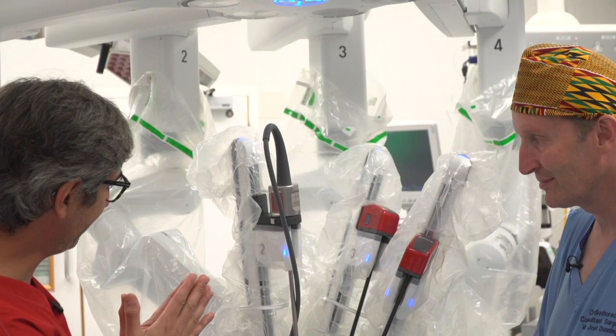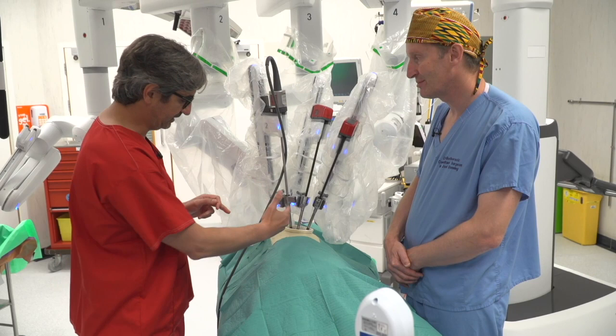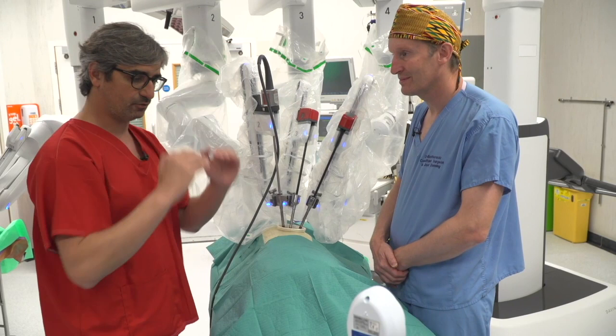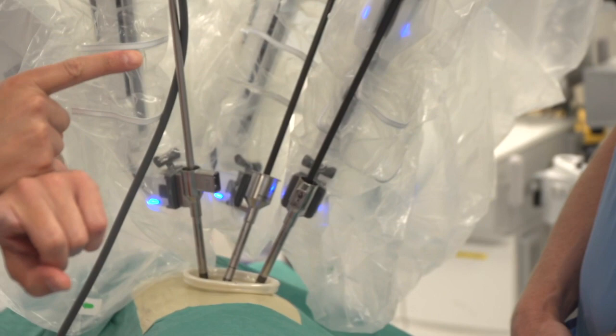Then, almost 98% of the time, the camera should be on arm two. So the camera, same concept as Uniportal VATS, is in the posterior part of the incision, to have the camera above your arms. Camera in the upper part, and arms three and four on the lower part, working in parallel. We don't need to cross the instruments. They work in parallel, okay?